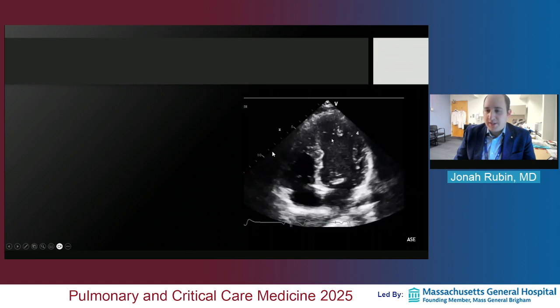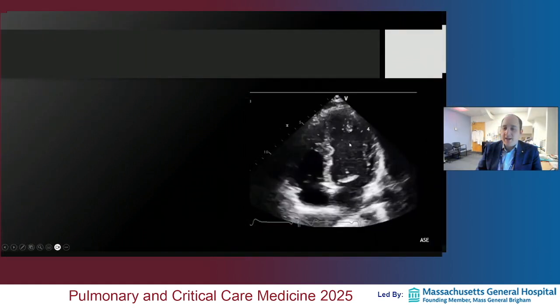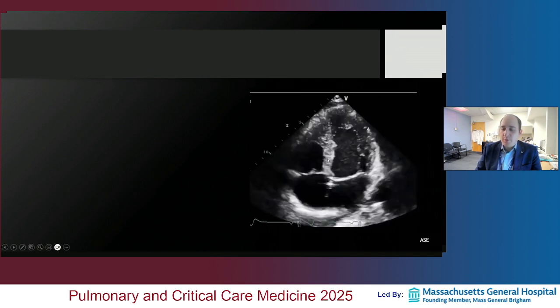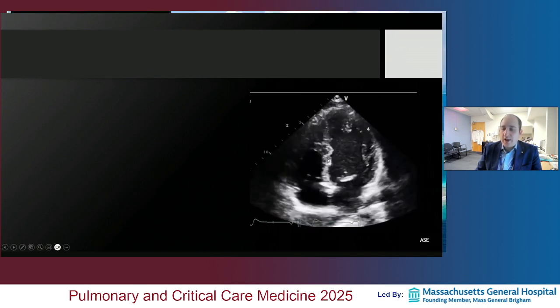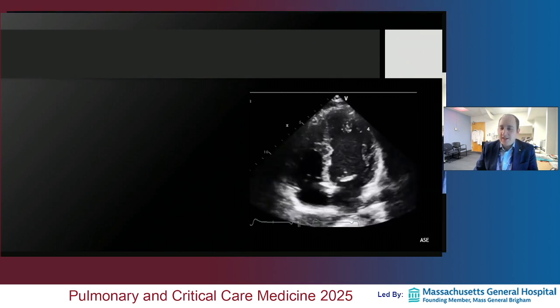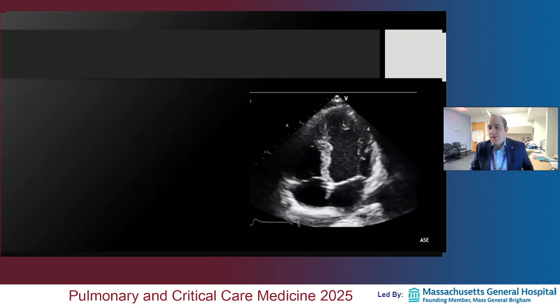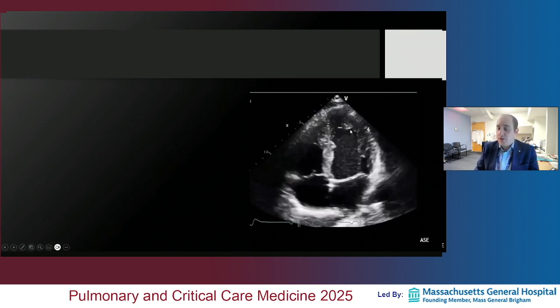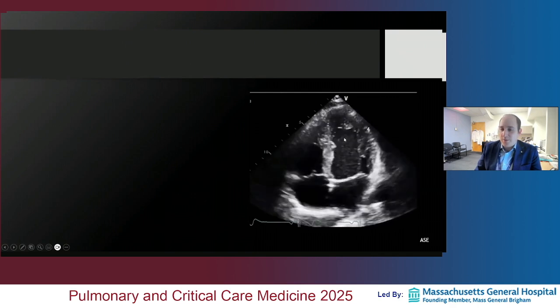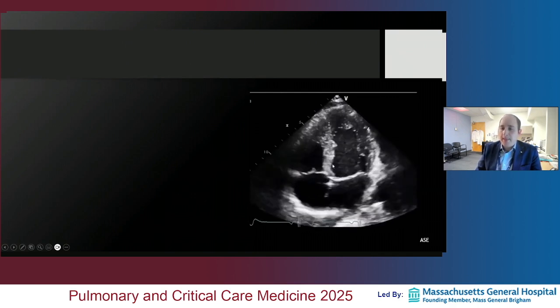Now, you also might be able to see that the left ventricle is larger and thicker, and those are usually features of the LV. But when you're determining whether or not your view or image is on axis, you have to have features that are true both in sickness and health. Because a seriously dilated and hypertrophied RV could also look like this. So you have to know that this is not RV some other way. And the way you know that is by seeing that the tricuspid valve leaflet inserts more apically here.